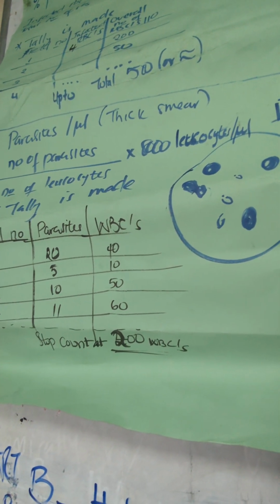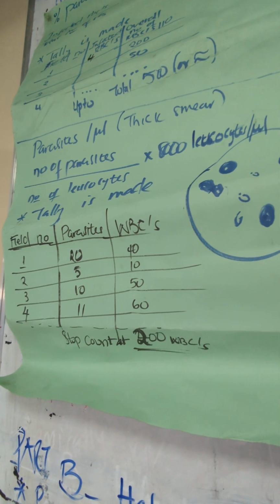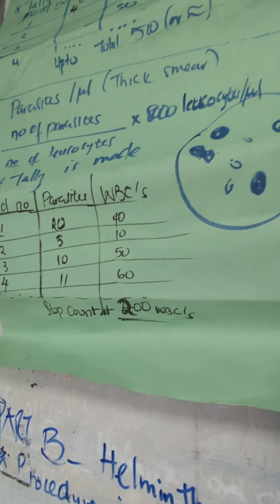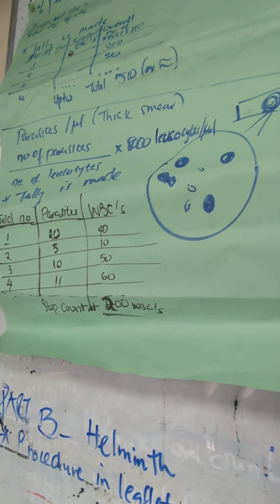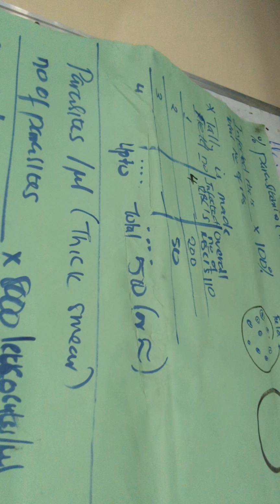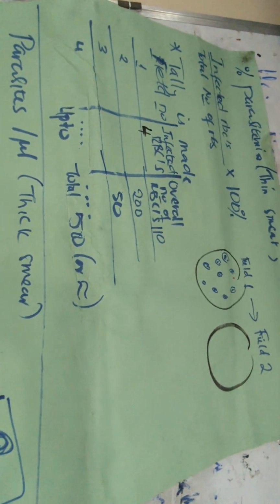So please apply yourself with the data provided, and then after that calculation you have to comment on the disease severity. Remember that that is part of task 3. Disease severity according to the WHO reference, very important. And then finally, percentage parasitemia. Just a quick wrap up here. Percentage parasitemia, I hope you can see.